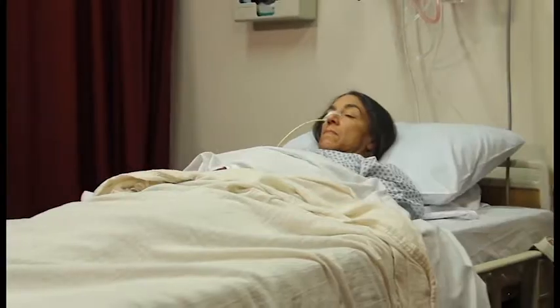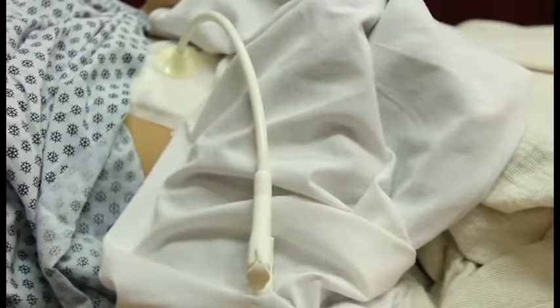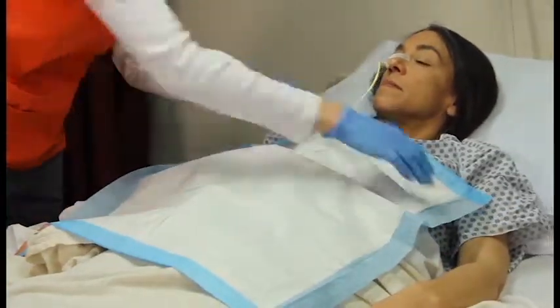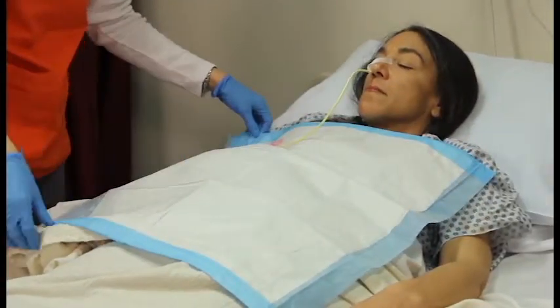For patients on enteral nutrition, or nutrition supplied through a feeding tube, caloric and medication requirements may vary. Therefore, their clogs may vary in hardness, texture, and consistency.